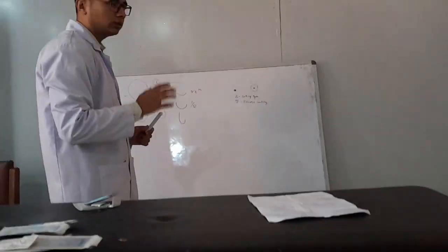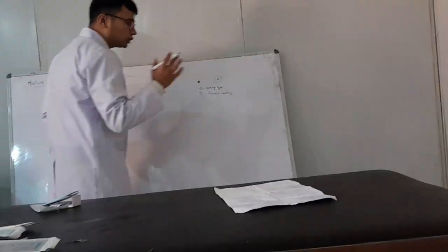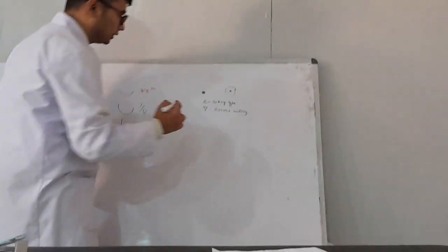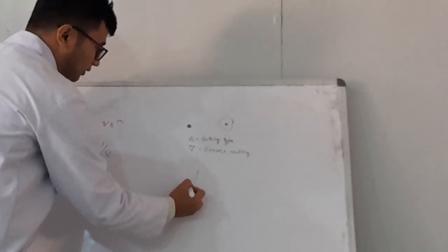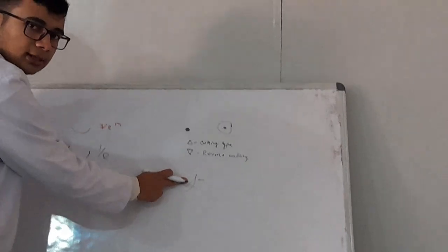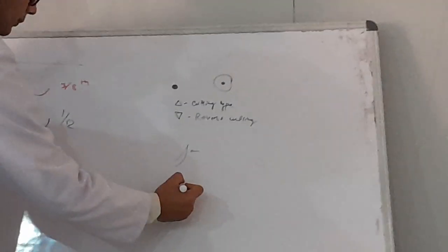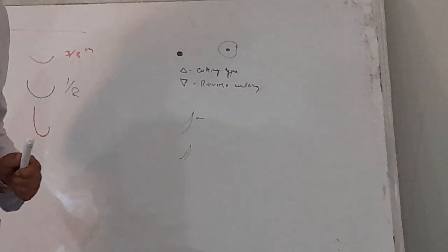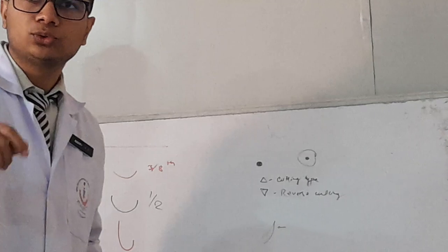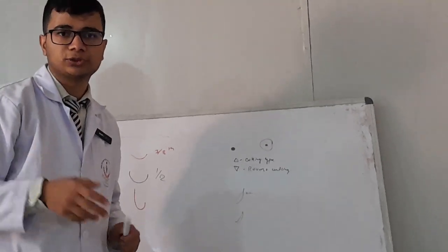Now we have talked about the body, now we will talk about the apex of the suture needle. Most commonly the apex of the suture needle is conical in nature. So this is the conical apex. Sometimes it can be a blunt apex also. The advantage of having a blunt apex is that while navigating the suture, there is less chance of a needle prick injury also.